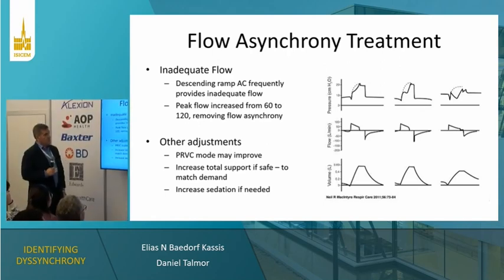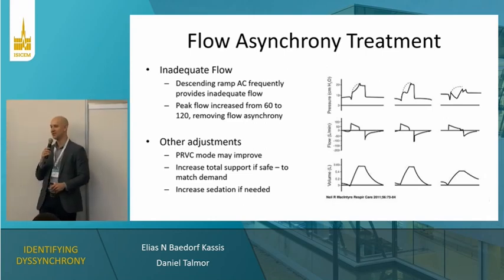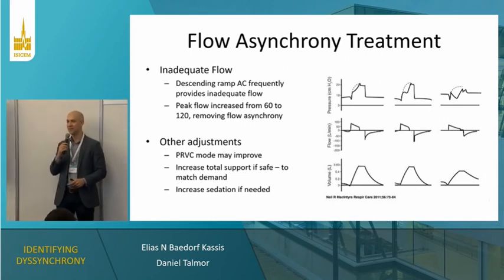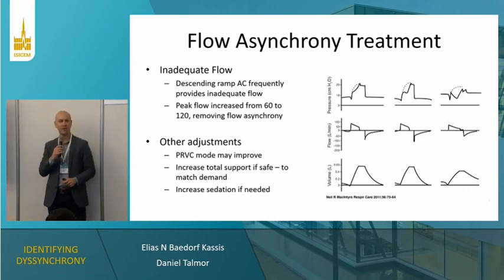Yeah, and that's a very excellent point, Danny, because we're looking at waveforms and talking about them, but we're not actually talking about the bedside evaluation of the patient. And these are often those patients who are going to be showing other evidence of it too: nasal flaring, jaw thrusting, potential other accessory muscle use as part of the exam. That's going to indicate that these are patients who are at high risk.